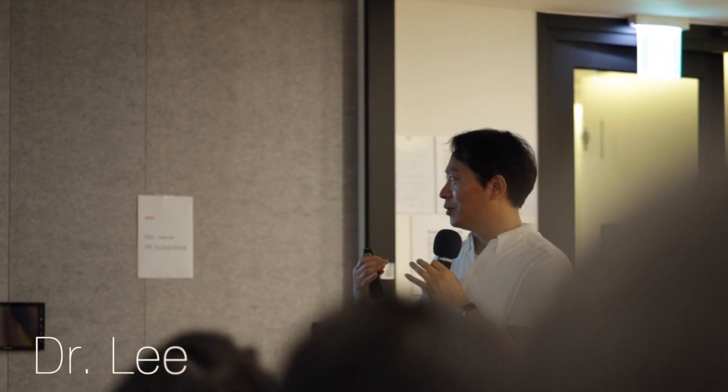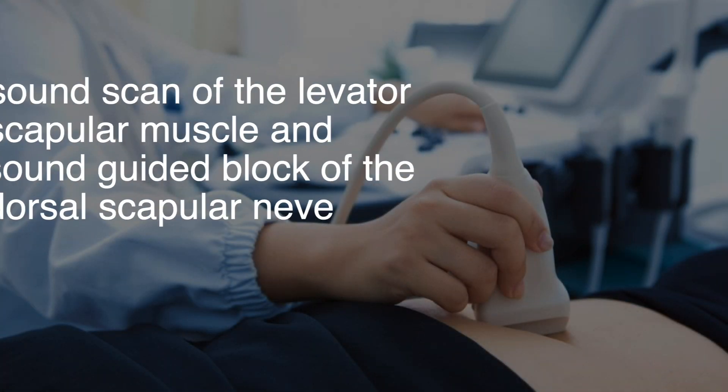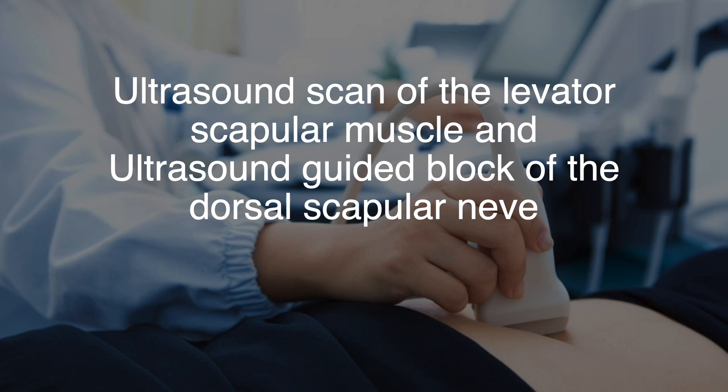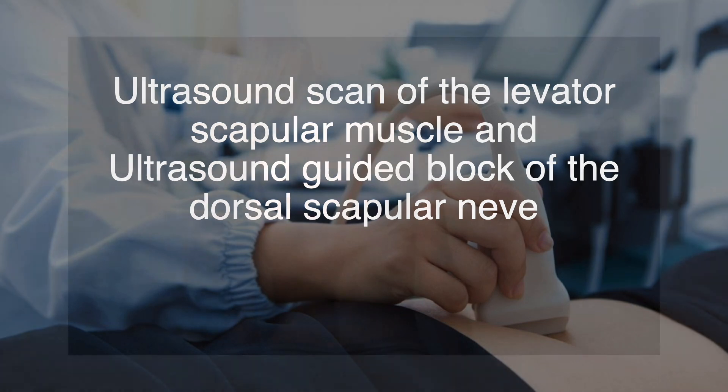Hello, I'm Dr. Li. Welcome to Practical Pain Management. Today I'll talk about the ultrasound scanning technique of the leviator scapular muscle and share an ultrasound-guided block of the dorsal scapular nerve.